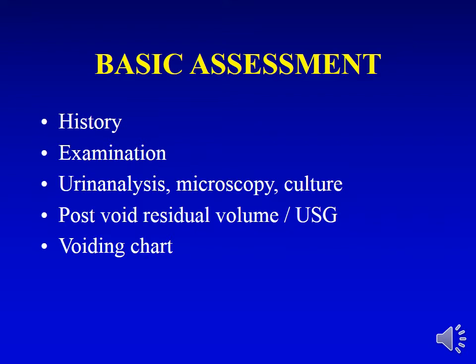Now, for urodynamic, we actually need to do a basic assessment before any urodynamic. We just cannot place the patient under urodynamic and do the EMG tracings and the uroflow and urodynamic cystometric tracings, and then make a diagnosis. No, we need to do a proper assessment, because why?